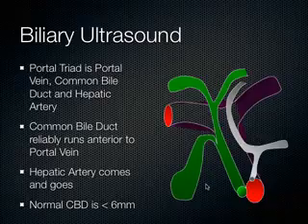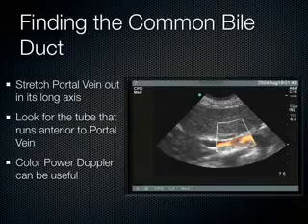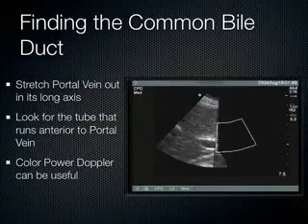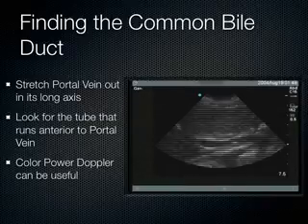Again, these numbers we're going to come back to next year, but I just want to throw them out here now. And by the way, the abbreviation CBD is something I constantly use for some reason, so just be aware of that. Common bile duct is CBD. Now, this is what it looks like. We can see that the portal vein is filling with some power flow, and anterior to that portal vein, that little sliver up there, is the common bile duct.